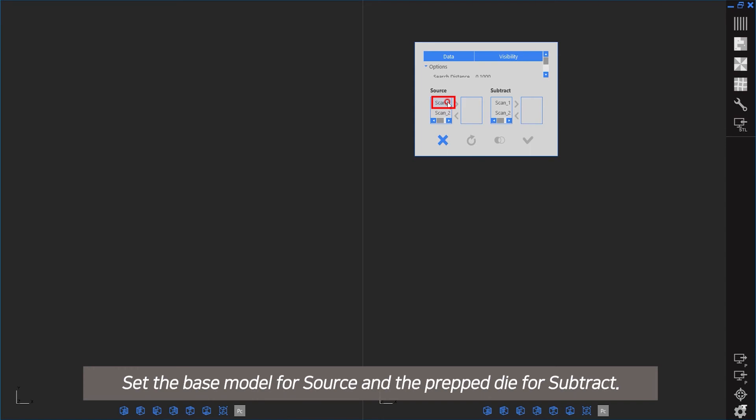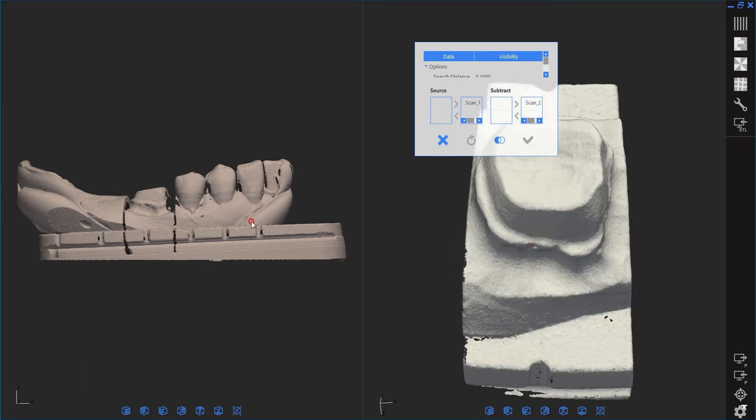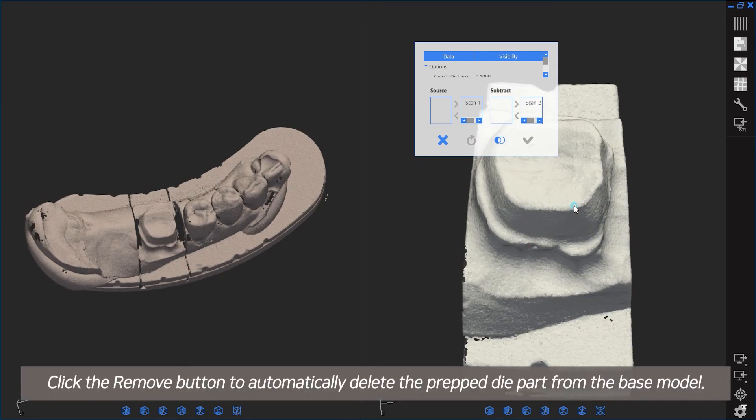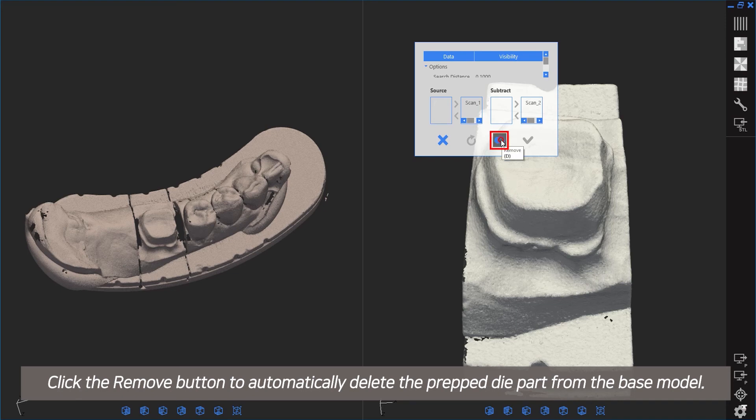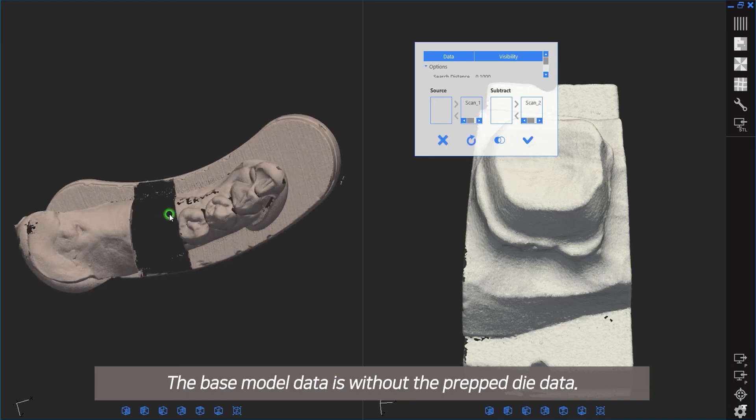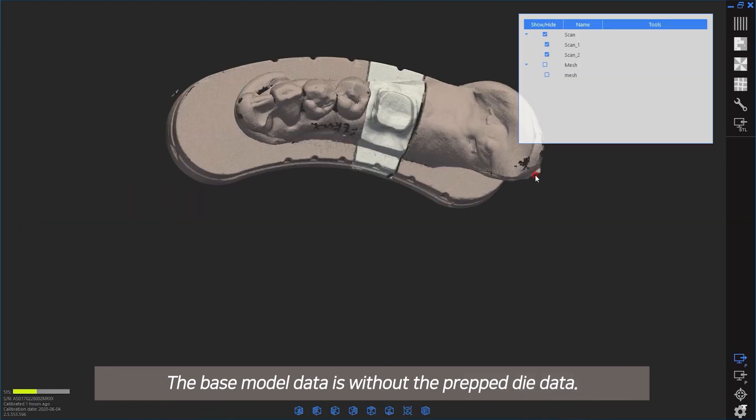Set the base model for source and the prepped die for subtract. Click the Remove button to automatically delete the prepped die part from the base model. The base model data is now without the prepped die data.